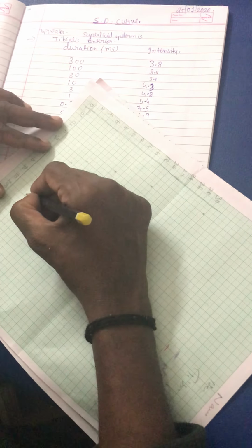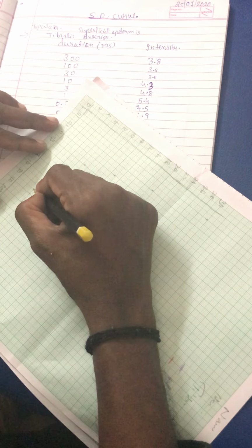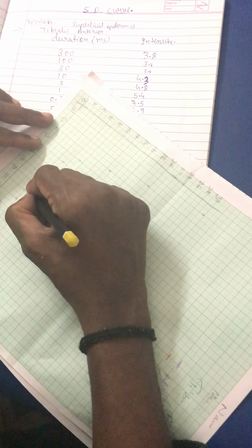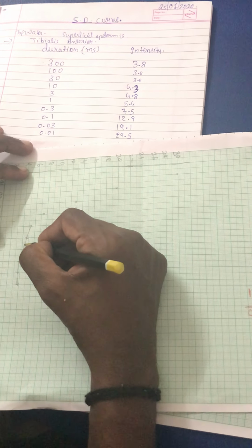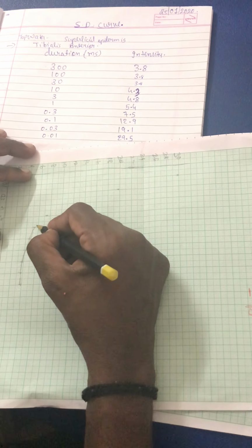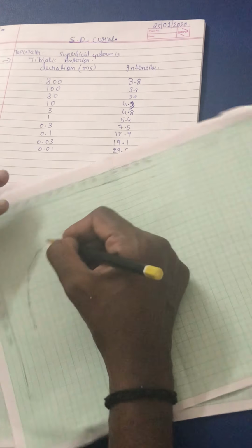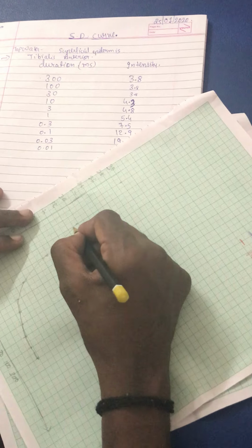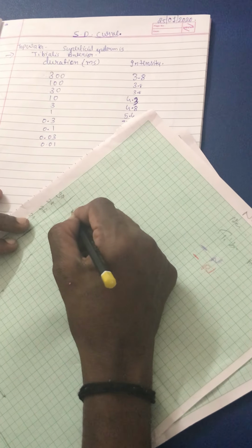Now what I am going to do is connect all the points. Okay, you can see now I finished the graph.